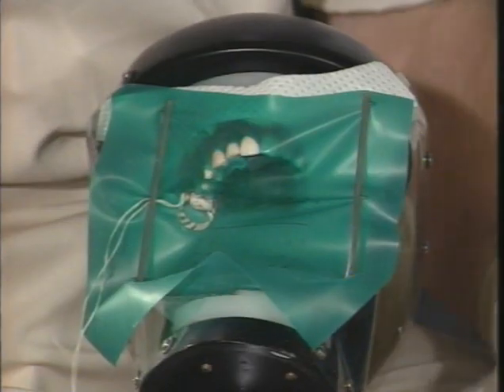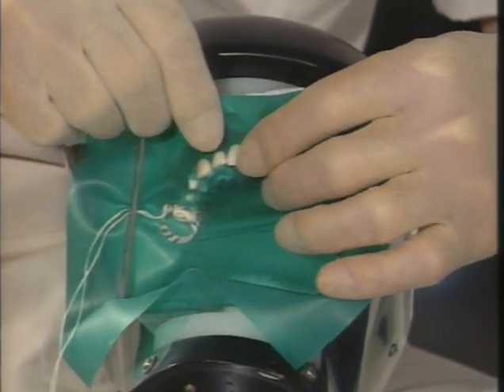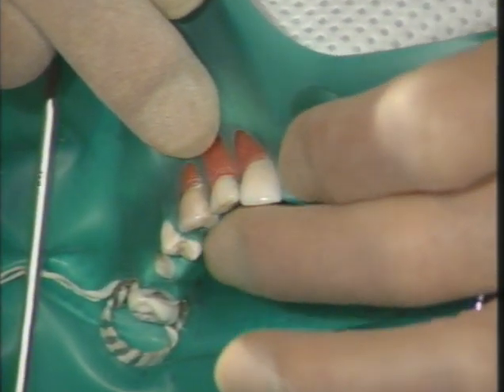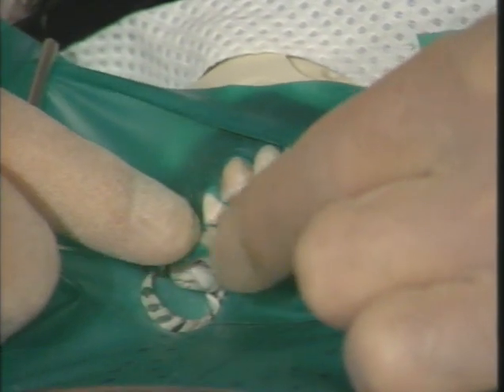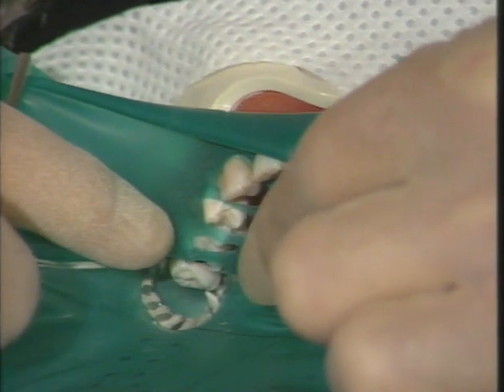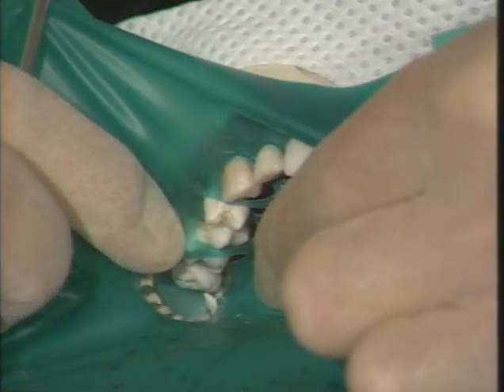I pulled the floss completely through the dam at this stage simply because it enables me to get a very much better seal around that tooth where the clamp has been placed. We're now in a position to put the dam properly in between the teeth because we've got very good access to the operating field. You'll find that in some of the areas the rubber dam has gone through the contact reasonably adequately, and in these areas you can just pull the dam through. In other areas, it's better to stretch the dam across the contact area so that the dam comes edge on into that space, and introduce that edge with a slight sawing motion through the contact, and this is generally called knifing of the dam.